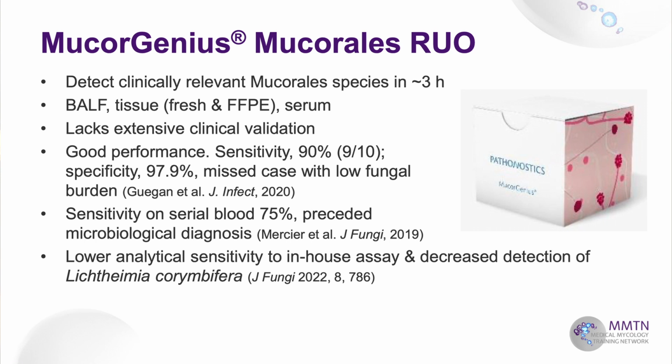Similarly, performance in blood, sensitivity of about 75%, which is not bad. And one recent review did report that it actually had lower analytical sensitivities to an in-house assay and decreased detection of the Lichtheimia organism. So, as I said, it's just not had a whole lot of validation in real life.